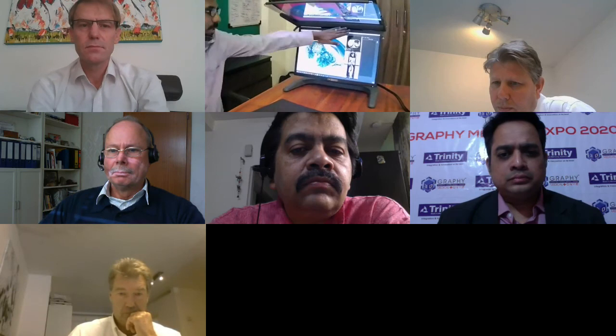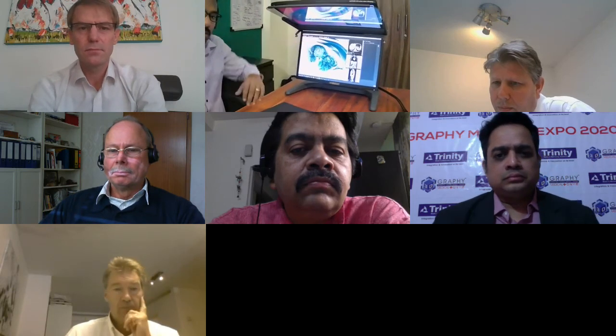3,205 Indian rupees. So we have 5 different models. This is a 22-inch model. There is a starting one without the tracker, so this is a compact one. The starting price is from 3.25 lakhs. And we have 24-inch, 27-inch and 28-inch. The 22 and 24 are the full HD version, and that is full HD per eye. And the 27 is 2.5K resolution.